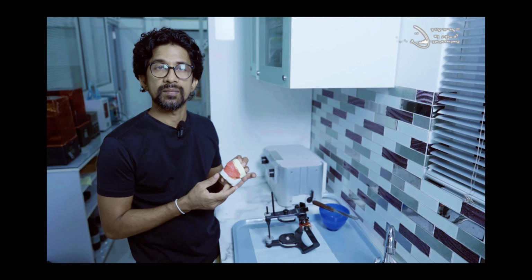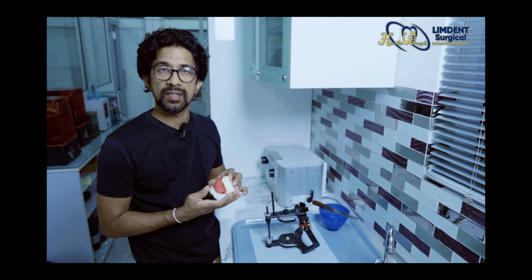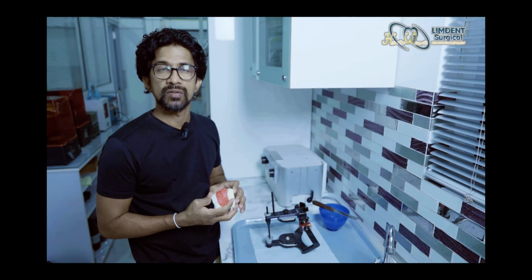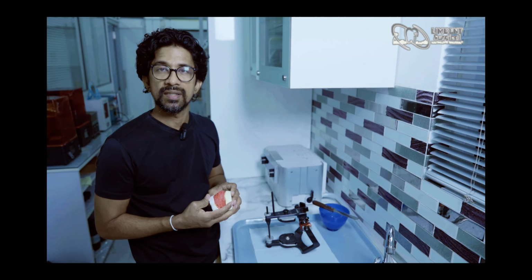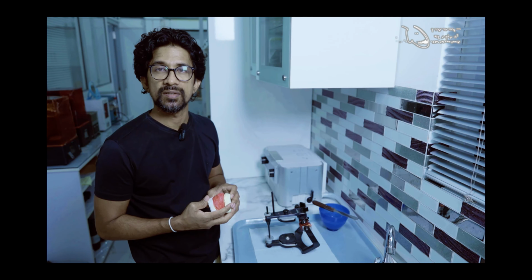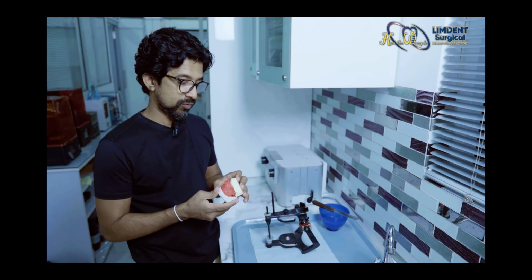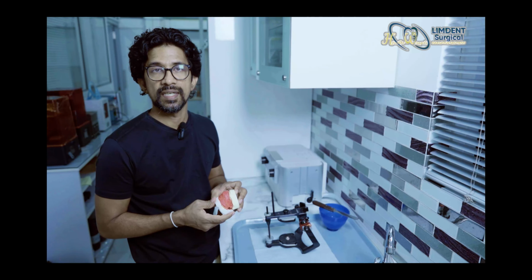At the same time, sometimes if it is a partially edentulous case, we can go for the teeth the way that we used to do in the conventional methods. You can also get the parameters from the patient if the patient is wearing a proper preliminary prosthesis that has been introduced just after the implant placement surgery. In this case, this is an intermediate bite registration of the patient just before going for the permanent restorations after the 6 months of implant healing.